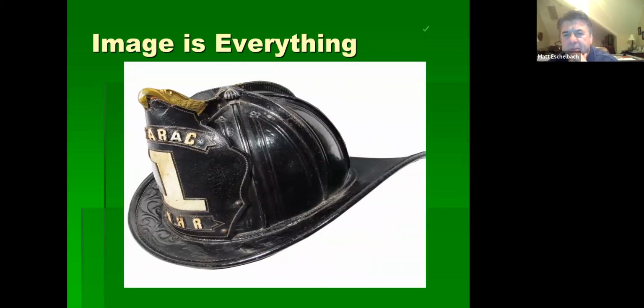All right, remember, image is everything. So this is a fireman's hat.